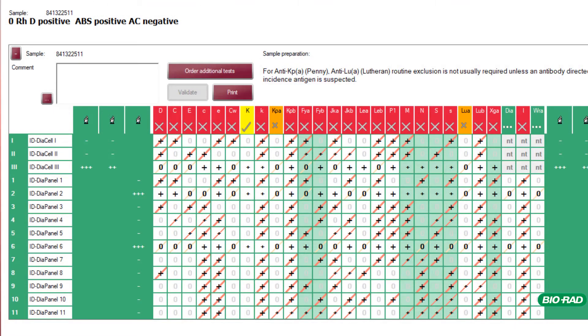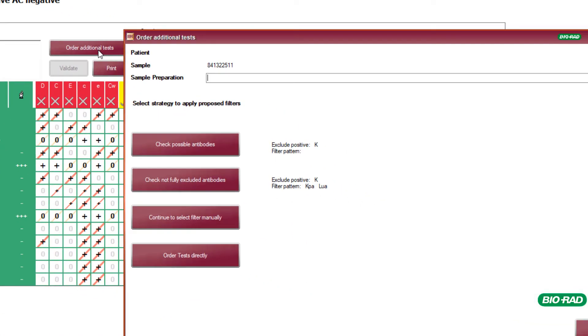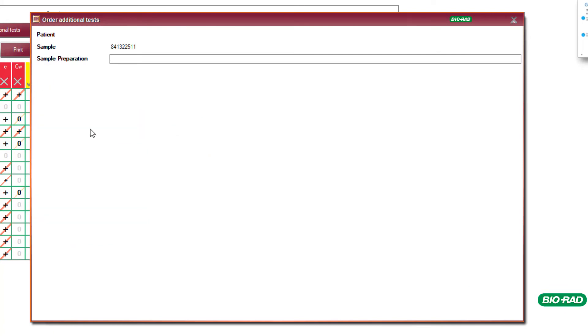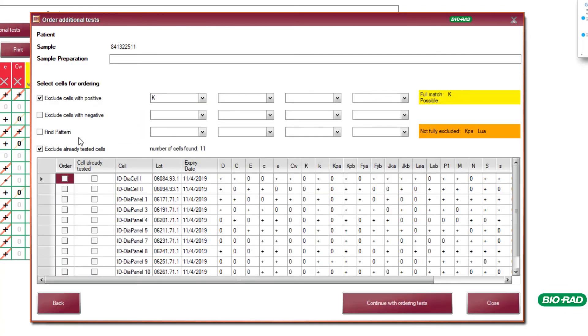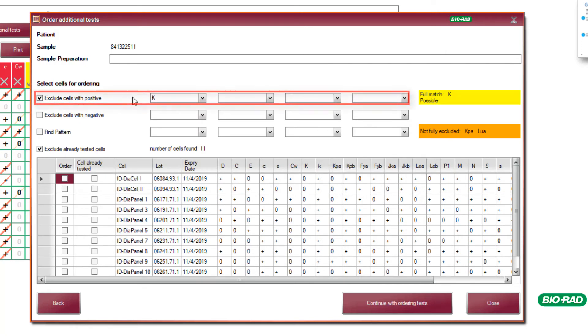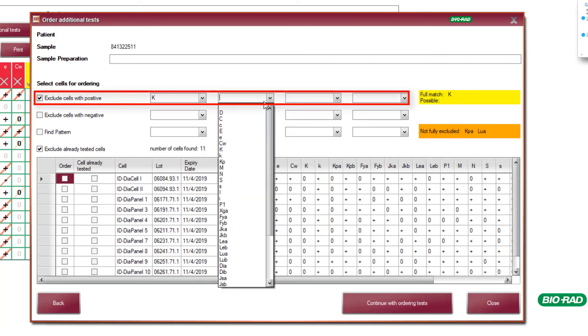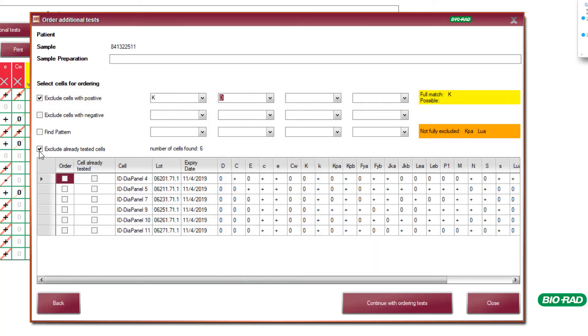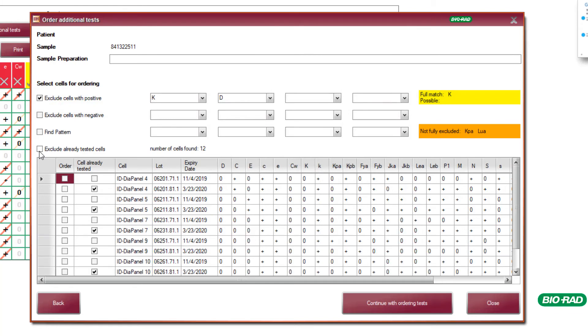The software has a tool for additional testing and further investigation. This tool will allow the user to filter through cells based on user defined criteria. The user will also easily be able to see which cells have already been tested on this patient.